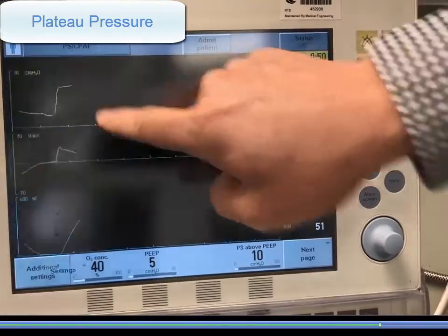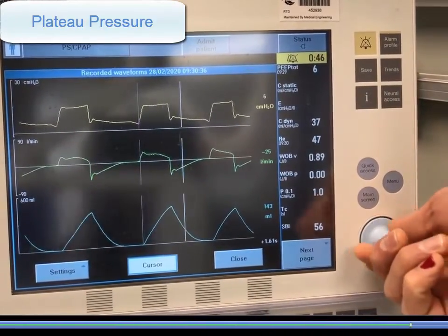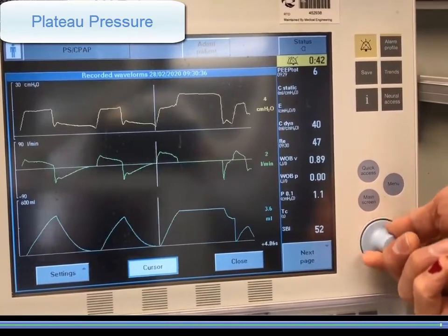Select menu, review, and recorded waveforms as before. Scroll over to find the plateau pressure, which in this case is 22 cm of water.